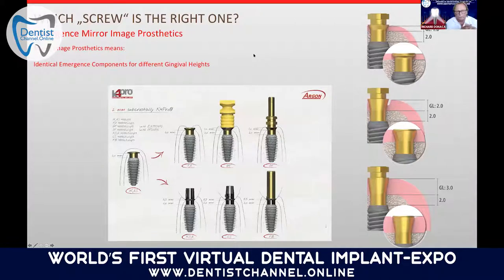What we call mirror image prosthetics is where, according to the gingival height that we come out of the bone level, if we are extruding here 2 millimeters at the bone level, then with 1 millimeter of gingiva, we need to have the cover screw, as well as the gingival former, as well as the impression post, as well as the abutments, all having the same profile.